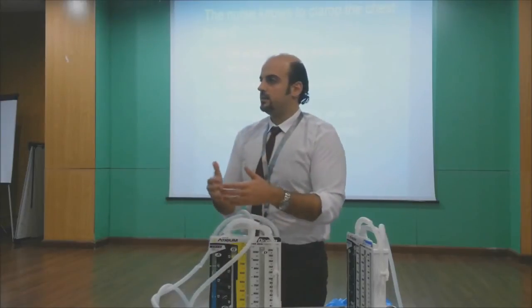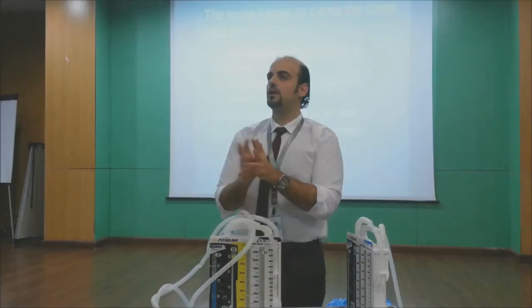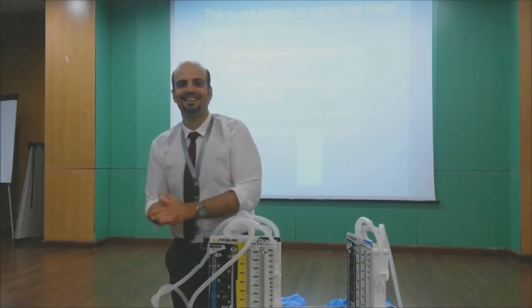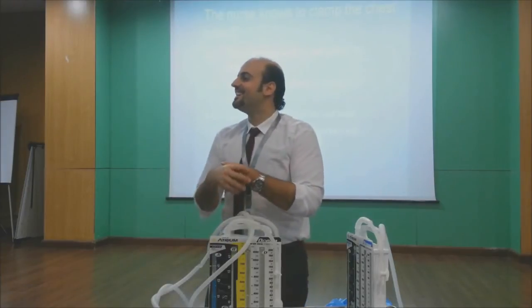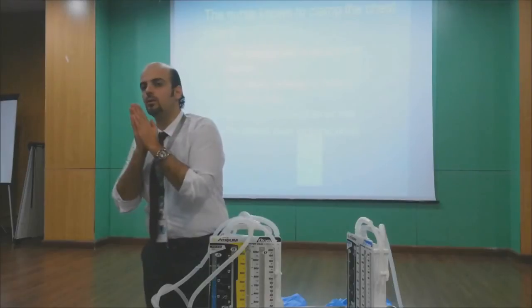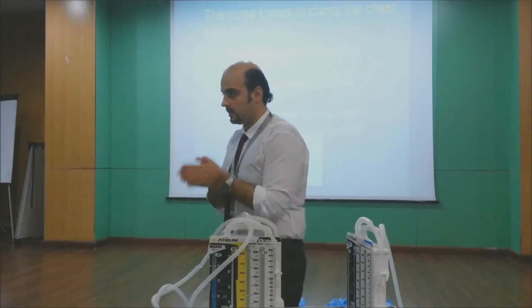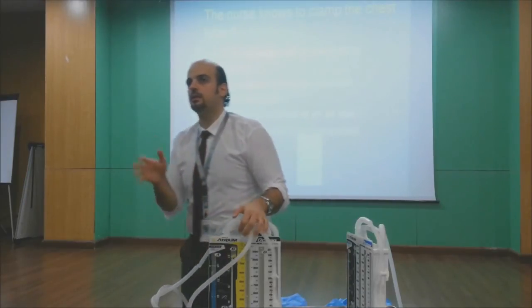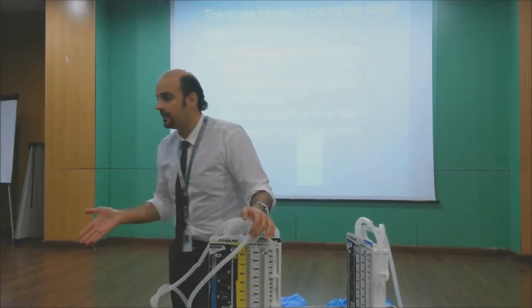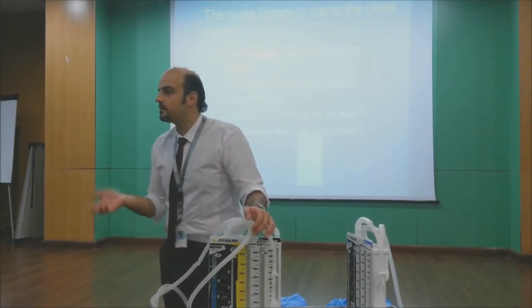Again, if there is no drainage, no oscillation, nothing, call the doctor to remove the tube. Actually, the first is from the side. What will they do? Sometimes, you are right. This is a very good question. Sometimes, when the patient is on a ventilator, there is a policy in medicine. If the patient is on a ventilator and the tube is not working, not draining, and I keep the underwater seal. Why?